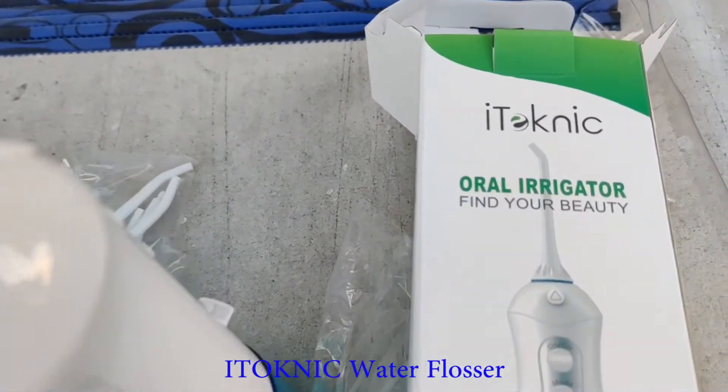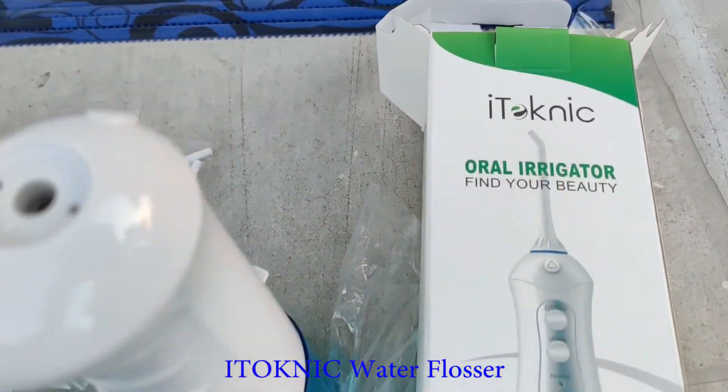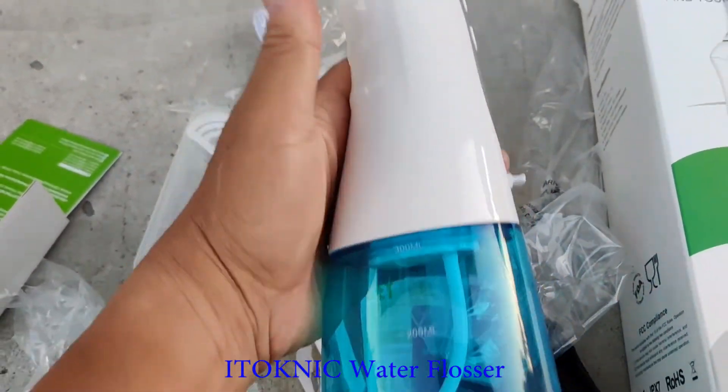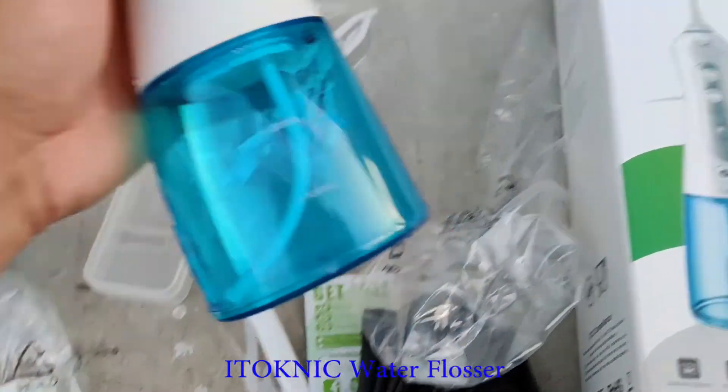New water flosser — iTeknic. Don't know what kind of name that is. There it is. Travel size.